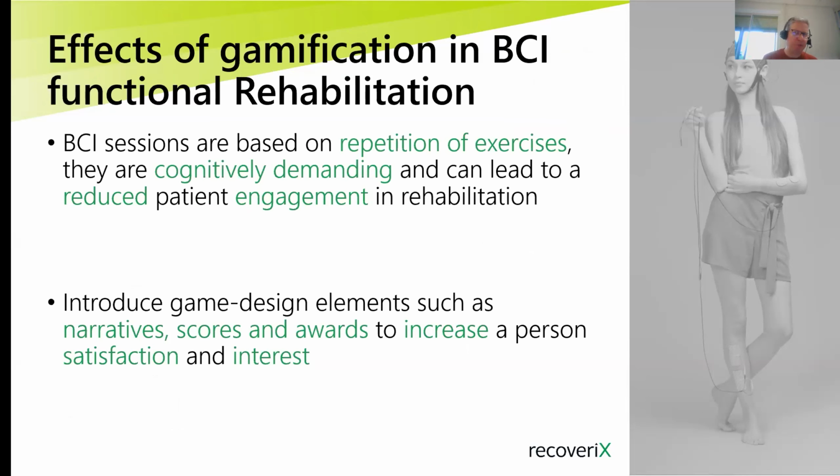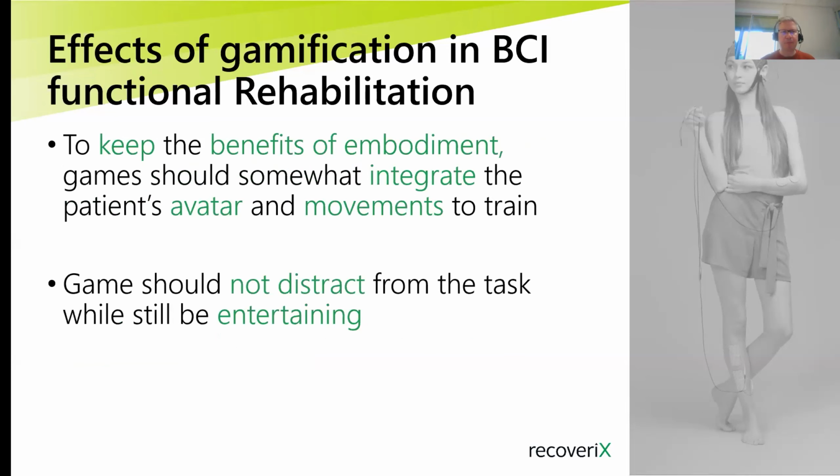This is why we introduced the gamification, to increase the satisfaction, the interest, the motivation, the compliance of the patients. But if you want to keep the benefits of the embodiment, you should have the same kinds of movements as in the original task. So if the task originally was to do wrist dorsiflexion, then also in the game it should be the same task, because otherwise it would be a different kind of training, and this is not what we want.